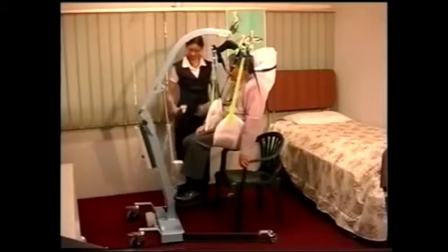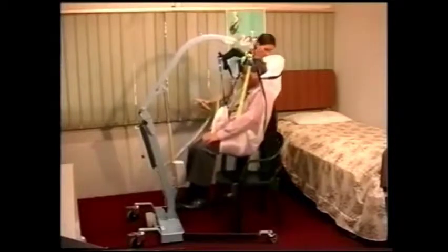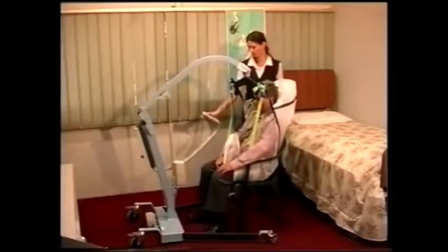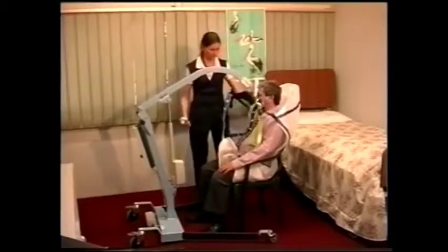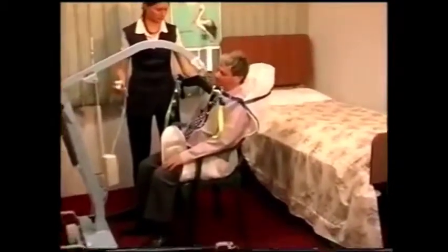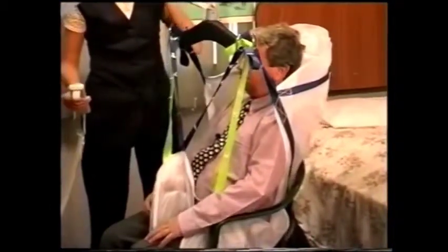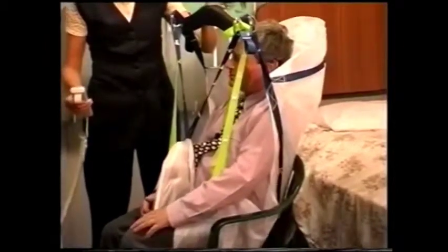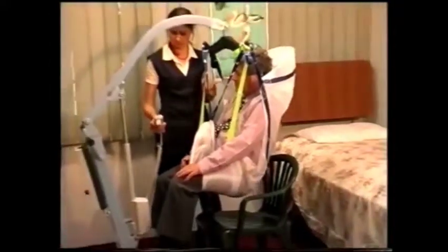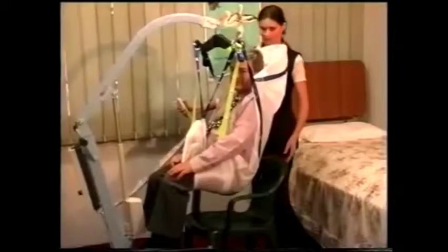Now, if you lower me down into the chair, even though I've got a slight recline back here, I should go into the chair all right. That's it. Rightio. And can you do that again and take me up again? And lower me down. I don't think there's any need, if you just position the chair correctly, there's no need to hold on to the straps at the back. Can you go around the back and hold the chair? That's enough. I think it might be right in. Yeah, I don't think there's any need to touch those straps.